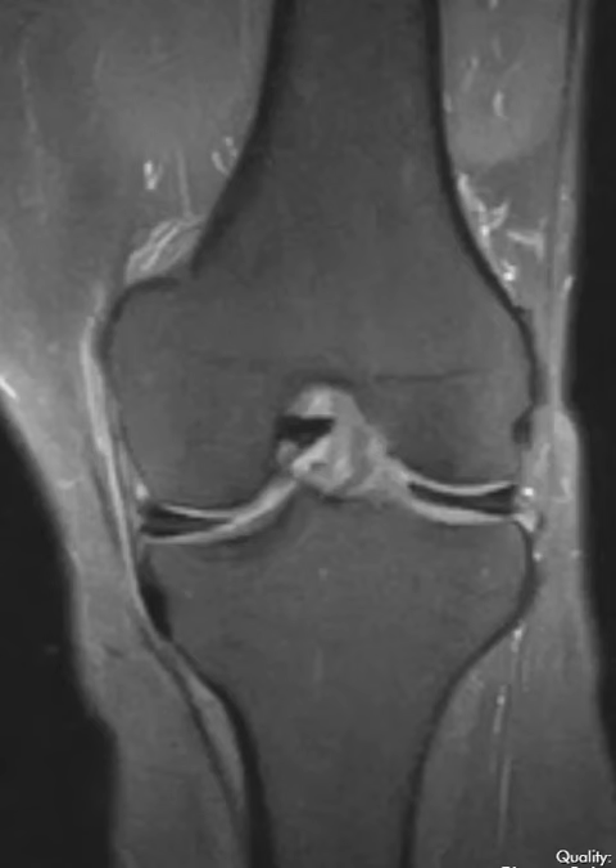Most often though we see it just incidentally — we see it and the patients are doing fine. In this patient they have a discoid lateral meniscus over here and the medial meniscus actually has a tear.